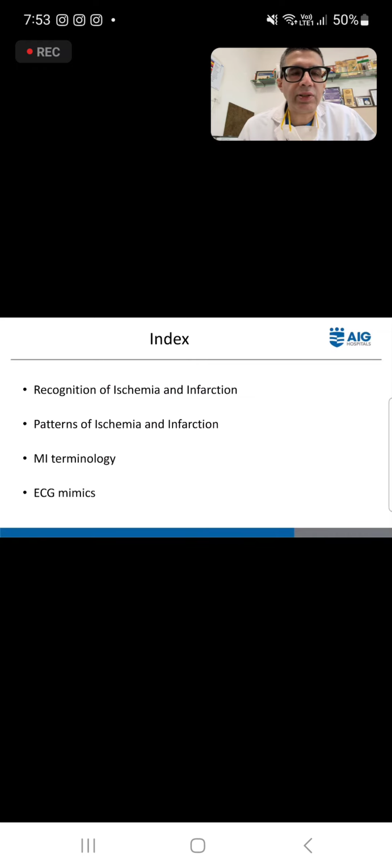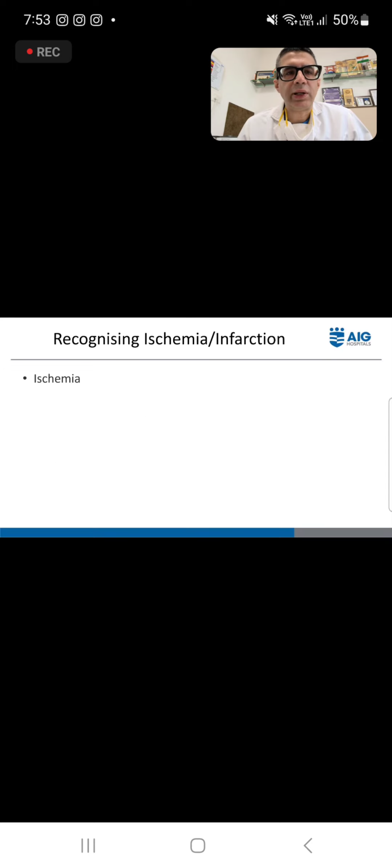So what we'll discuss in this presentation is the recognition of ischemia and infarction. What are the patterns, and some of the questions which we asked? What is the terminology which we use in myocardial infarction, and what are the ECG mimics for myocardial infarction? So I think we'll continue tomorrow.